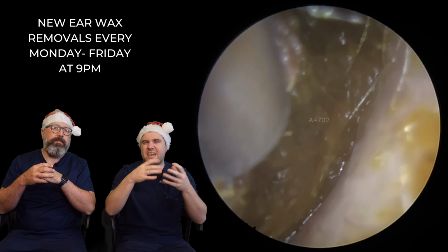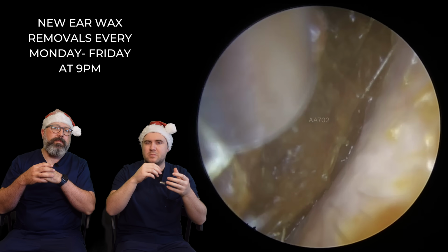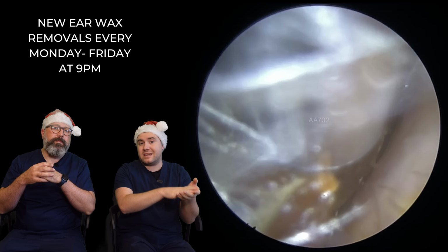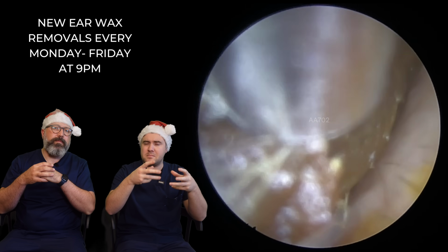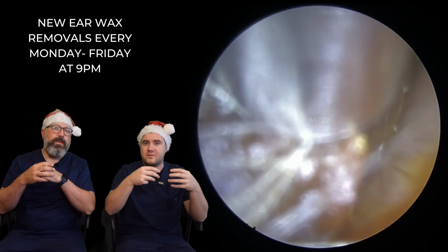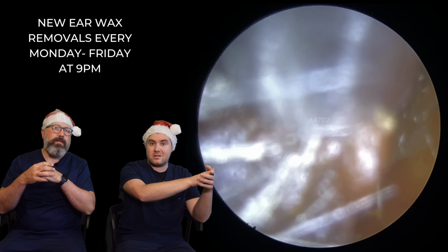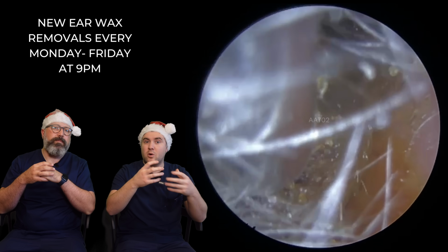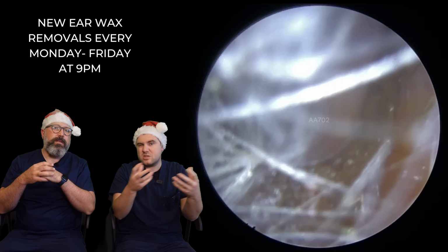Now you will again sometimes see us remove some of the loose hairs that have come away and that have dropped inside the ear. Sometimes you can get some ear canals that have quite a lot of hair a lot deeper into the ear, but that's not where we expect cilia to be. So we always kind of know that that's loose and ready to come out.